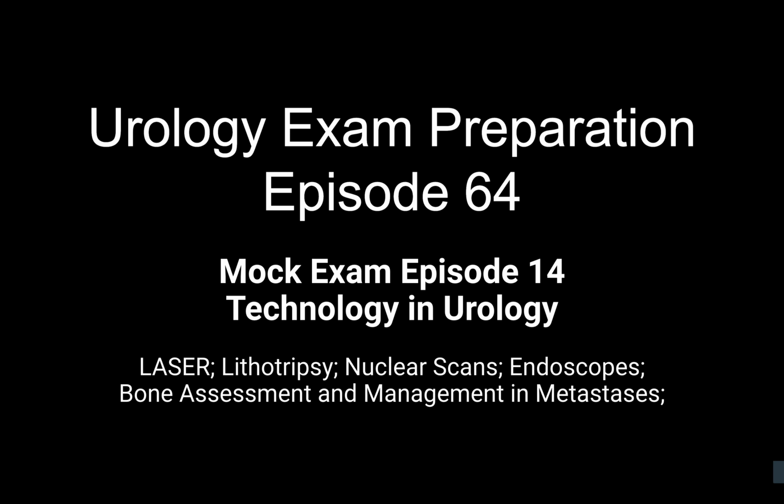So I'll explain to her that laser is an abbreviation for light amplification by stimulated emission of radiation. It works by having a lasing medium, which gets pumped by an energy source, inside a chamber. The laser I'm using for this procedure would be holmium YAG, or holmium yttrium aluminum garnet. That is the medium, and that gets pumped. When it gets pumped, the electron from the lower orbit goes to the higher orbit. Then when it drops back to the lower orbit, it releases photons. This process is repeated throughout the medium, leading to release of these photons.